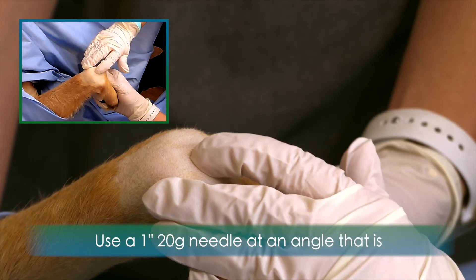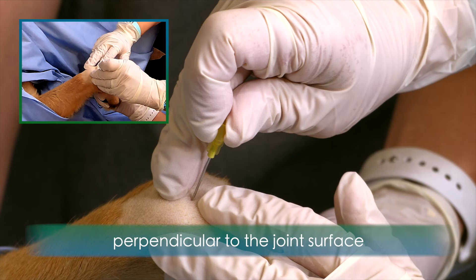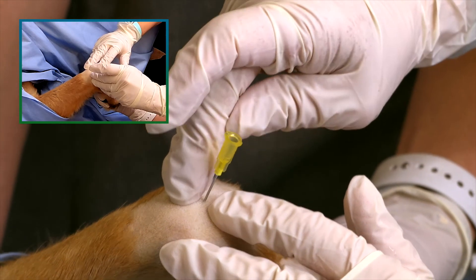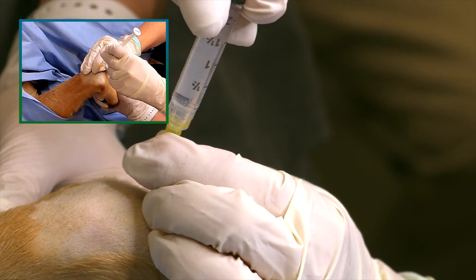Use a 1 inch, 20 gauge needle to penetrate the joint at an angle that is perpendicular to the joint surface. Avoid penetration of the cephalic vein. Advance the needle into the joint and observe for joint fluid. You may not get much joint fluid from this particular joint.